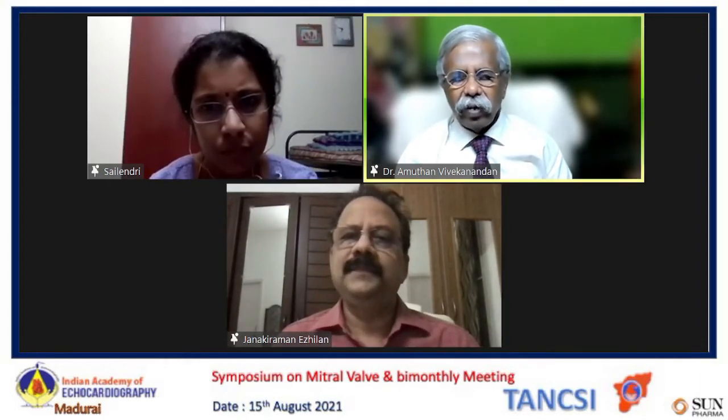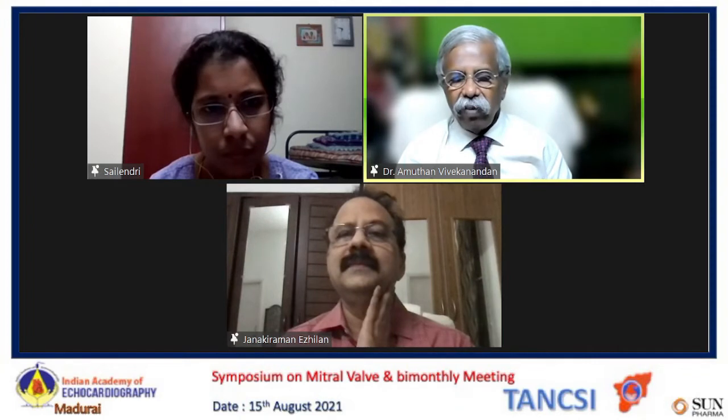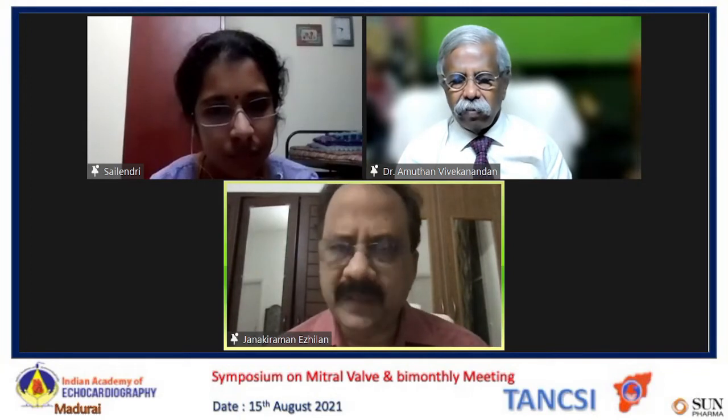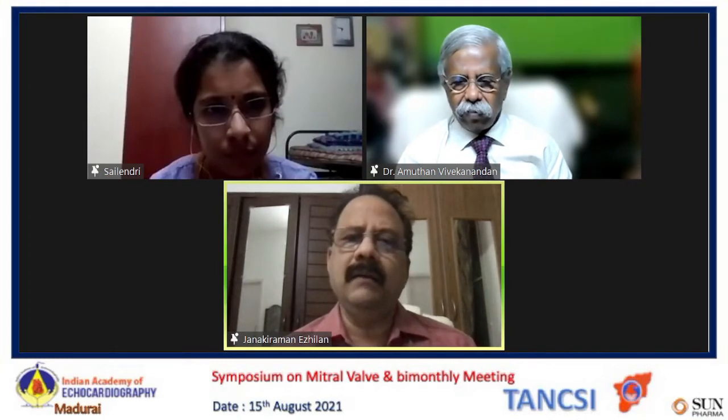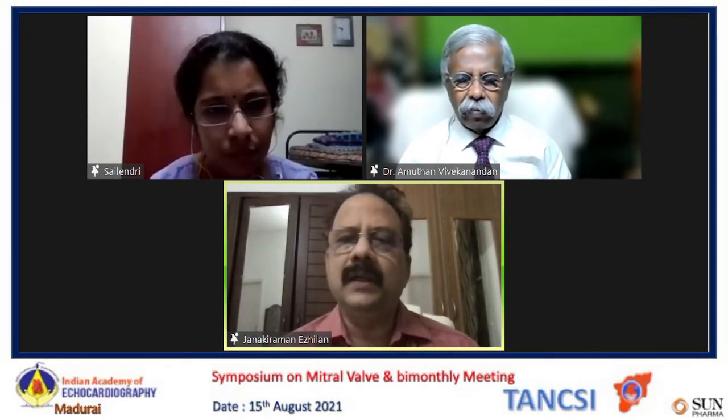There is one question from Tuklas: what is the limitation of PET CT in native infective endocarditis? Yeah, we do use PET CT in patients with native valve infective endocarditis. If the infection is active, it does show enhancement or red spots in the inflammatory zones. We don't have vast experience, but in this case, PET CT did show that there was inflammation in the lungs and not in the aortic valve.